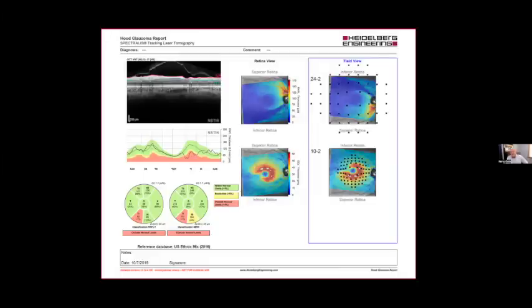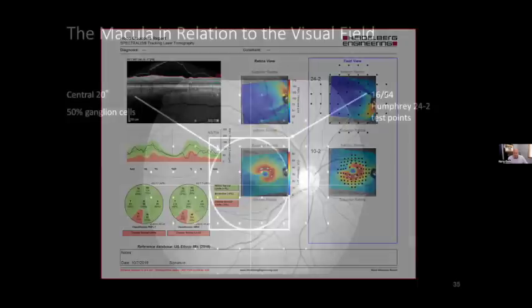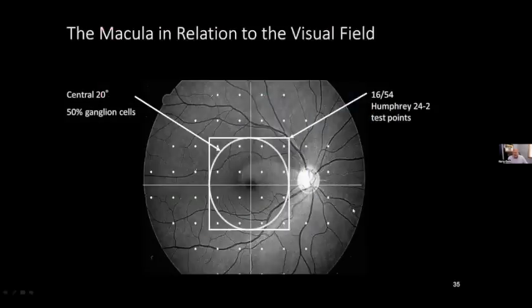Yeah, let me answer a couple questions on this if I can. Dr. Gonzalez, at one time there was a 24 or a 30-1, a 30-2, and I think a lot of people don't know what -2 means or -1 means. If you could explain why they picked -2, and no longer is there a 24-1 or a 30-1 or 30-2.